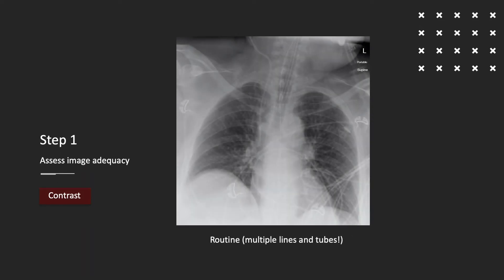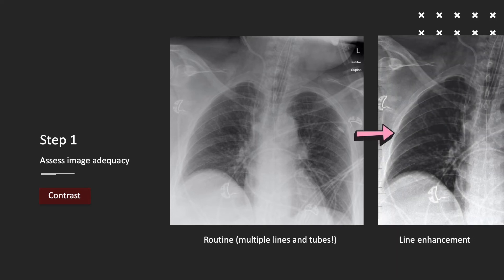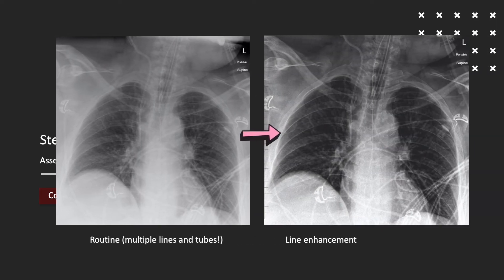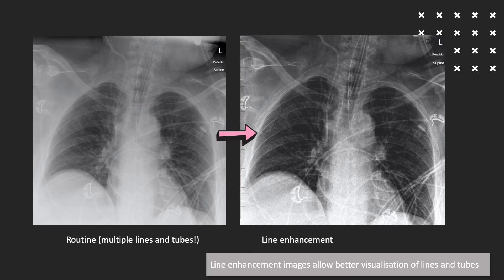Alternatively, look for a companion line enhancement image. These are images performed with a specific image processing algorithm that highlights tube and line features. The image is processed by the radiographer and may be available in some cases.